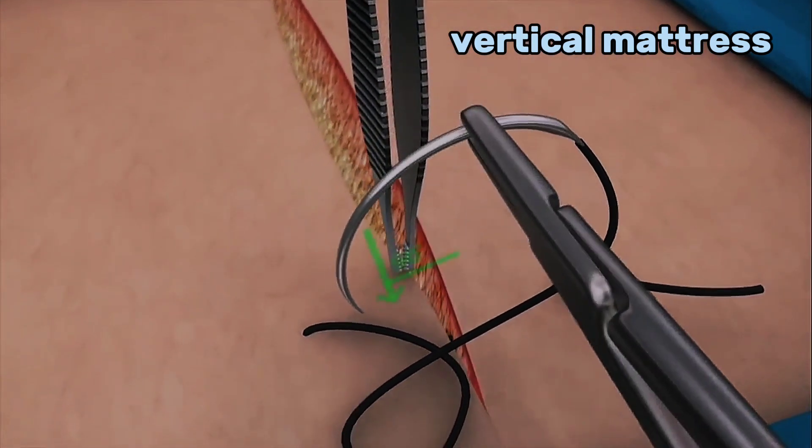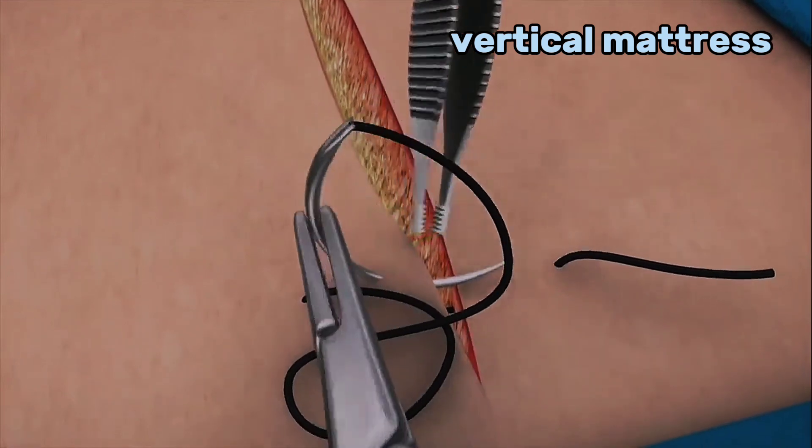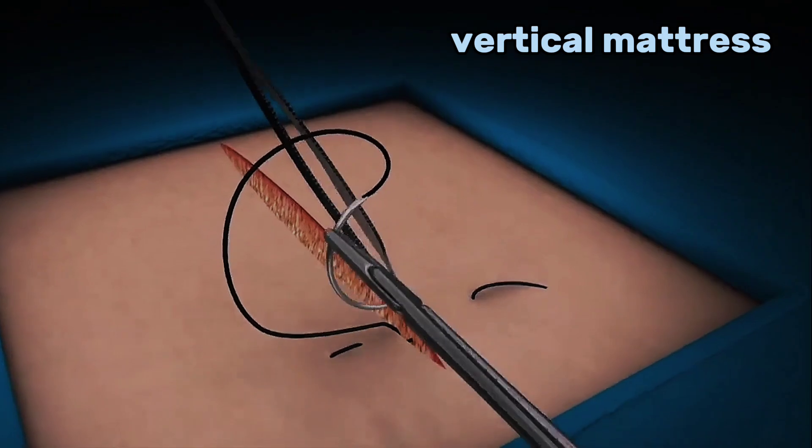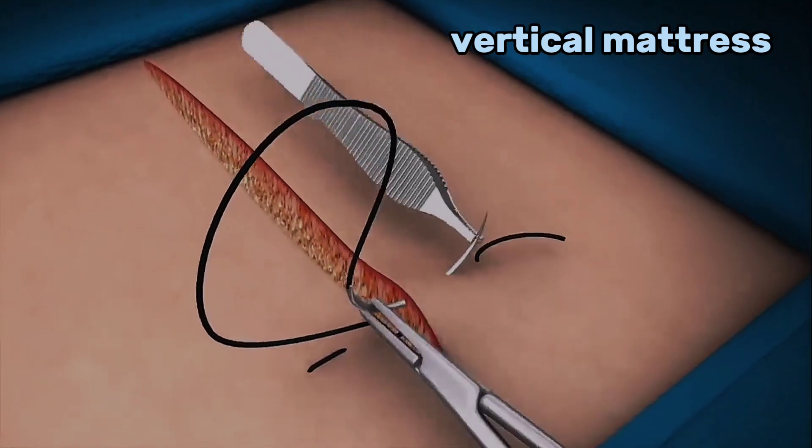Using the backhand technique, enter the needle at 90 degrees to the skin and rotate the needle through the tissue by pronating the forearm. Repeat on the opposite side of the wound from inside to outside.